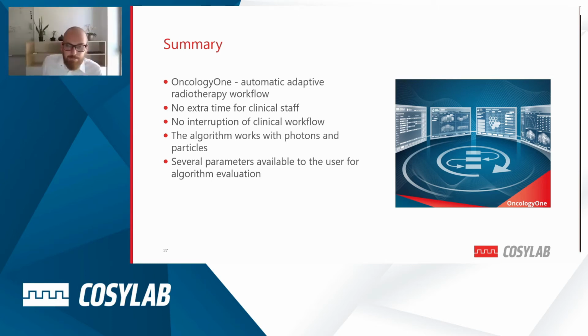Thank you, Kristjan. You mentioned everything, and also Niek said that it's a waste to use CBCT just for a position check and not for anatomy changes. Basically, we use it to check the anatomy changes, but it's only visual, so we don't have any numerical data which we can evaluate and decide based on. So sometimes these anatomy changes could be on a big scale, and for these cases we need to decide what is the next step for the patient.